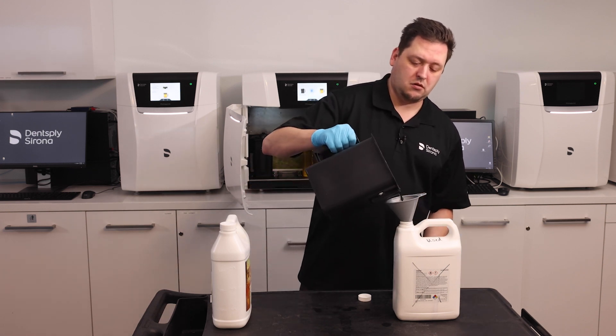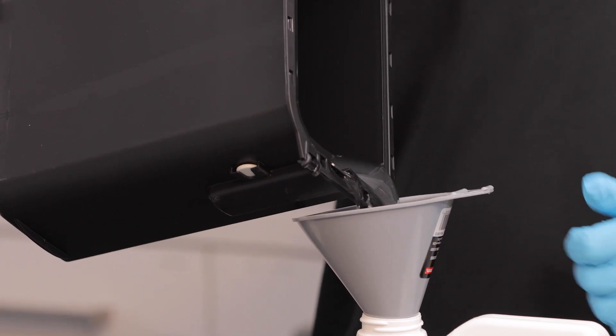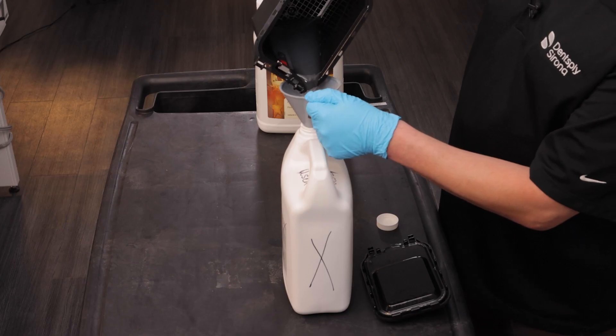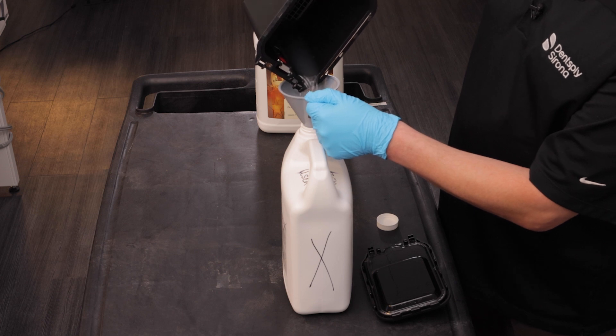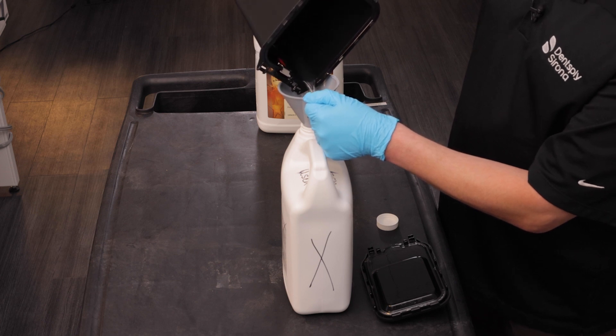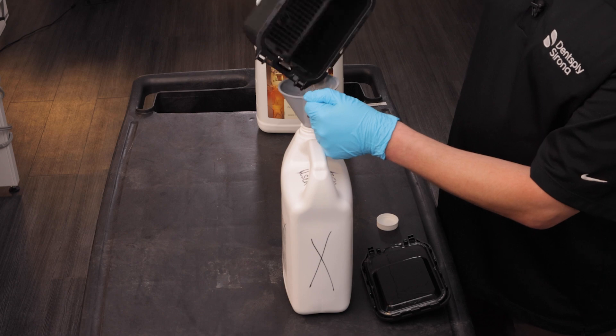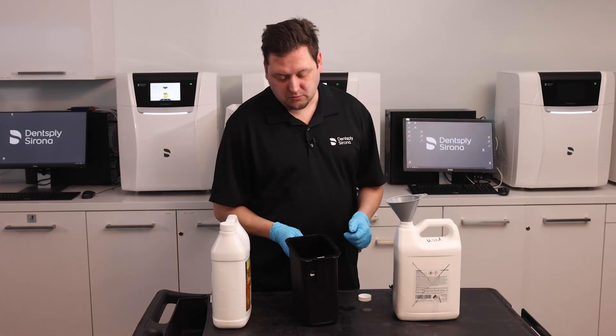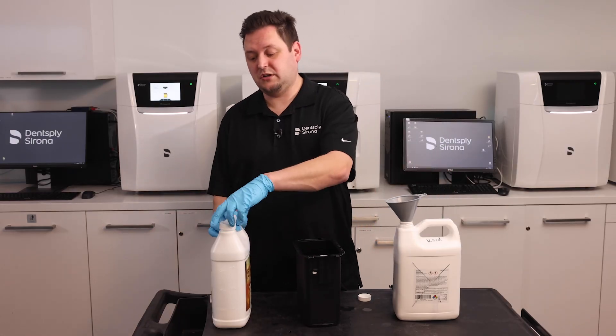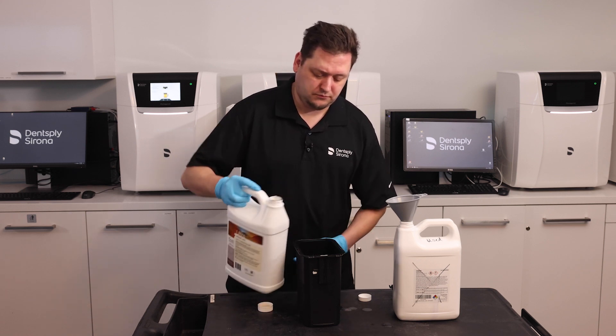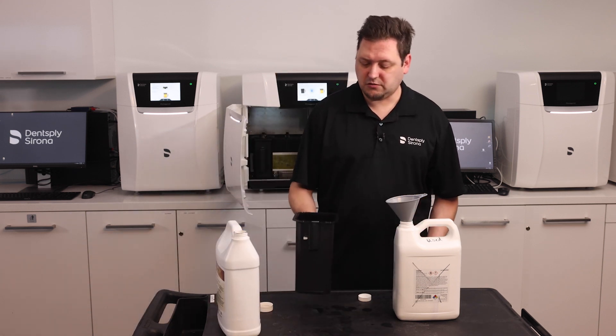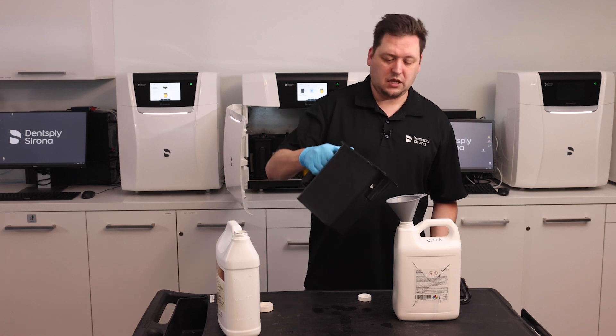Again, pour the rest of the alcohol away. Now if I still see any deposits or want to give it an extra rinse, I can put in some fresh alcohol, just a small amount. Again, swish it around a little bit and pour the rest.